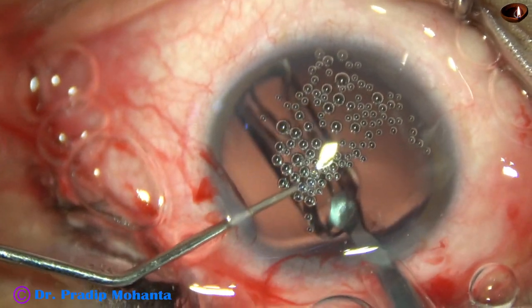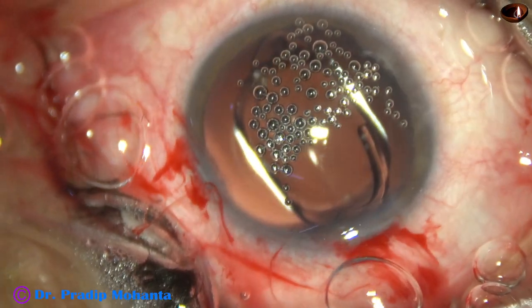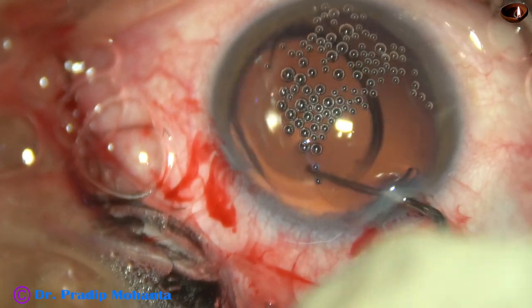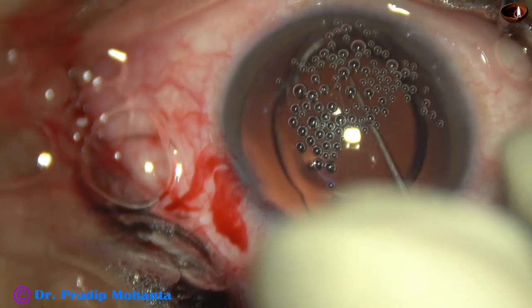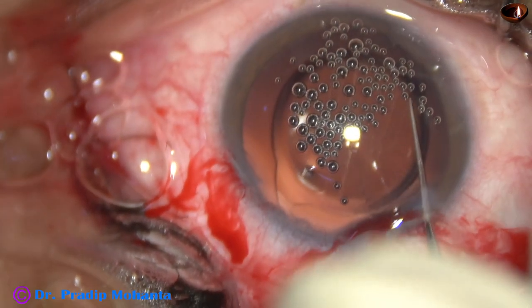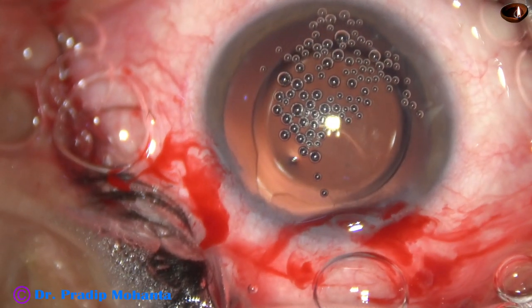Now this is a hydrophobic acrylic single-piece monofocal intraocular lens. The capsular bag and the anterior chamber have been filled up with HPMC, and then this lens is placed in the capsular bag.